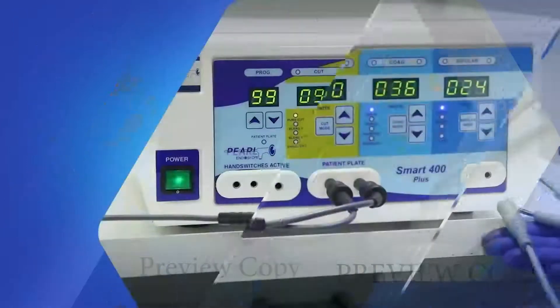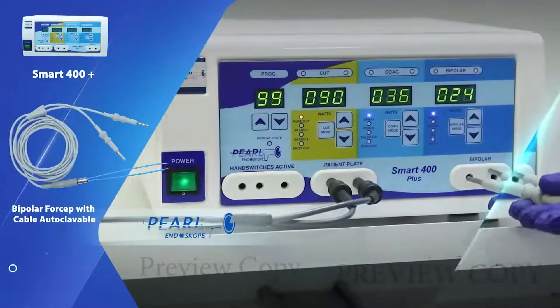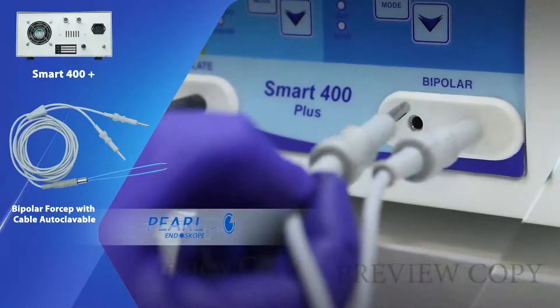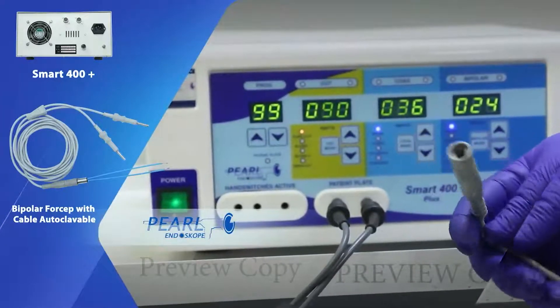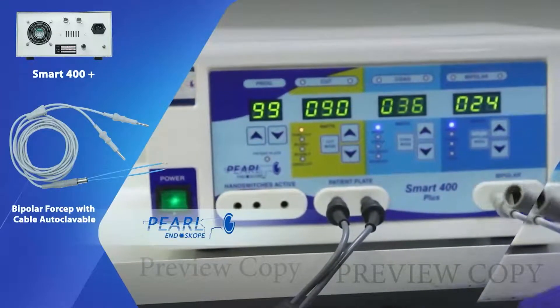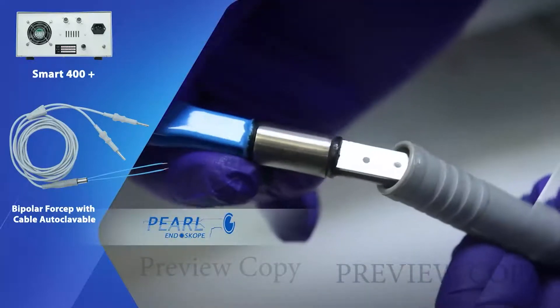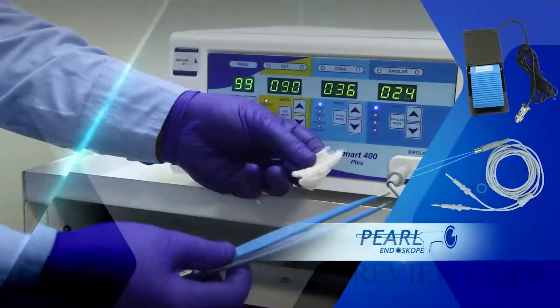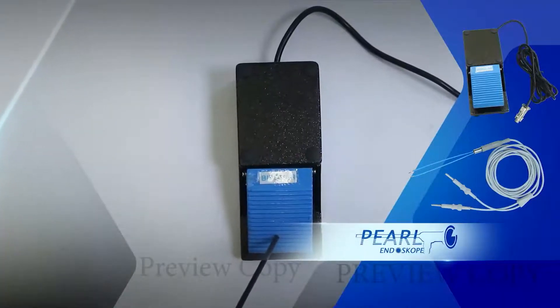To use the bipolar forceps, we attach the cord to the machine at the bipolar port. To the other end of this cable, we attach the forceps.